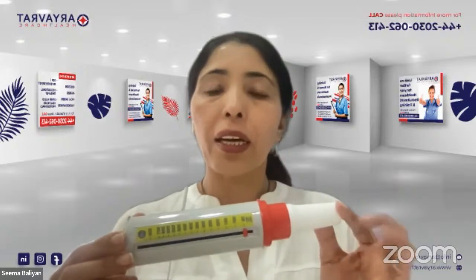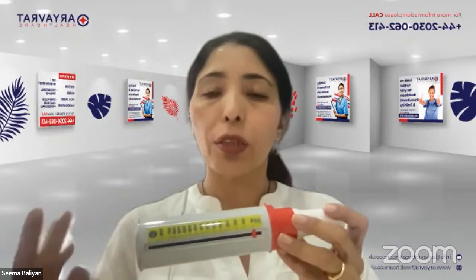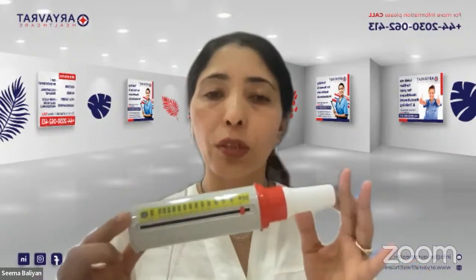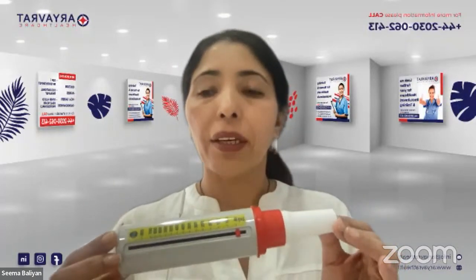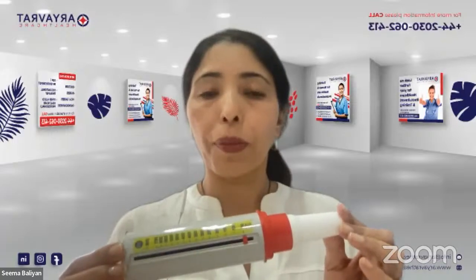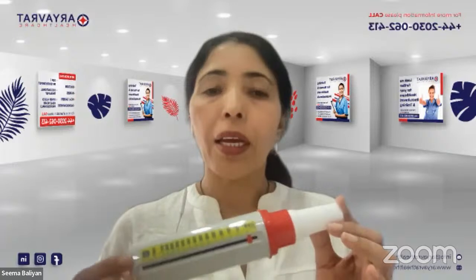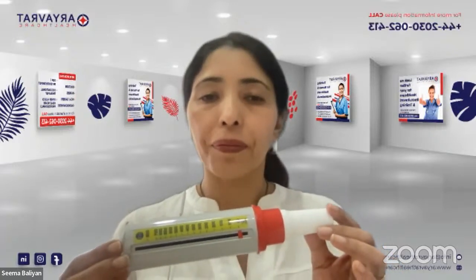For the first thing, the what and why are the two questions we are going to answer first. You are going to say that this is an instrument, and this instrument is called the peak flow. The reason why we use a peak flow is to measure your lung capacity and also to make sure that your inhalers are working.